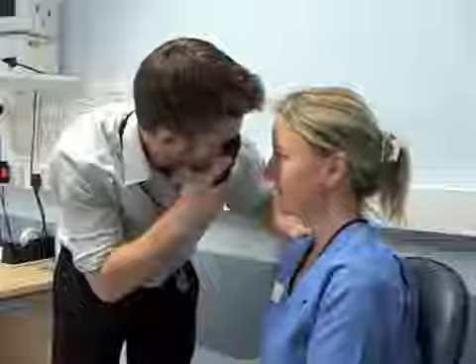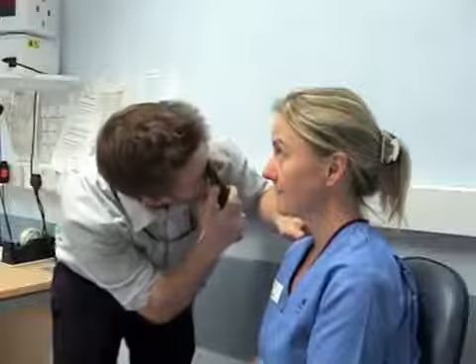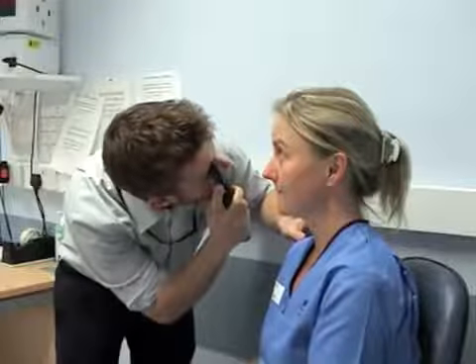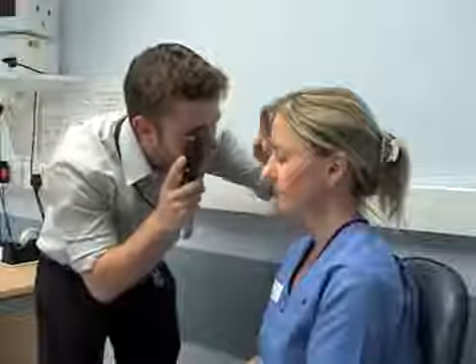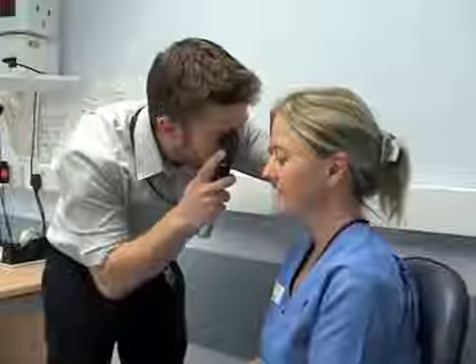supranasal arcade, infratemporal arcade, infranasal arcade, and finally looking at the macula. It is important that when examining a portion of retina, one asks the patient to look in that direction and moves in the opposite direction. This brings the desired area into view and allows examination of more peripheral retina.